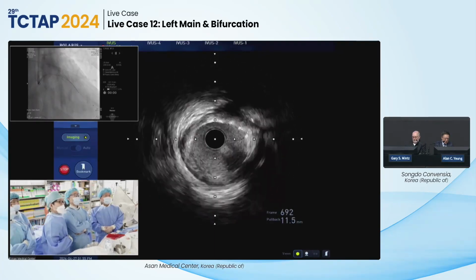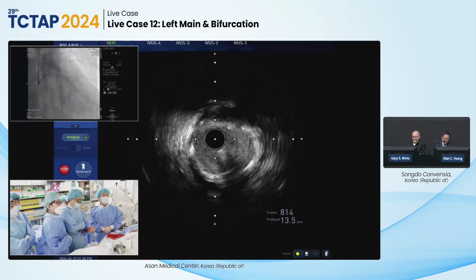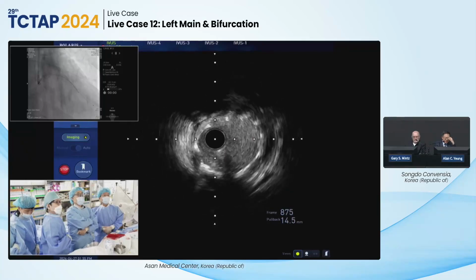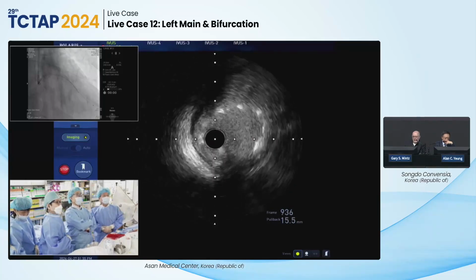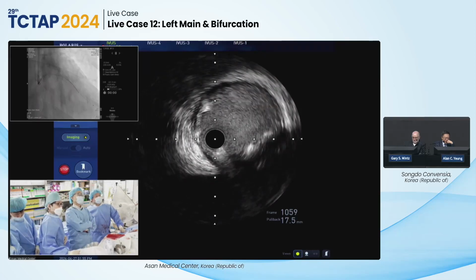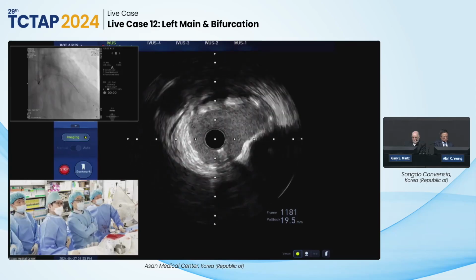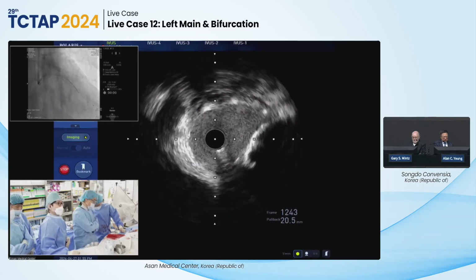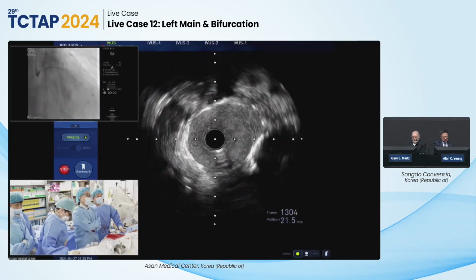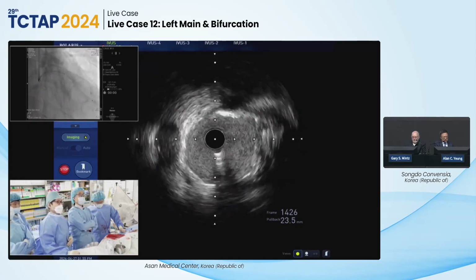It's a little bigger. I think it's quite good. Stent area wise is more than five. Pretty much the stent diameter is diagonal, so much width. Upper right-hand corner. I think this area has been dilated to 4. Yeah, and there's a little bit of noise, so I wouldn't totally perseverate about the measured area.